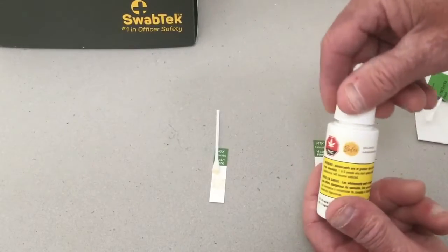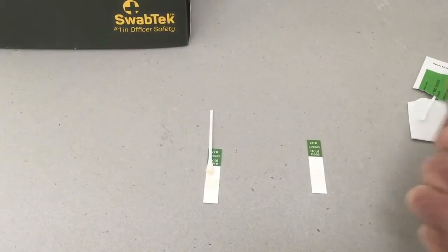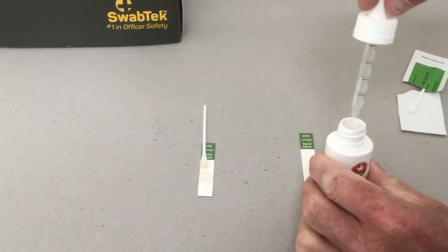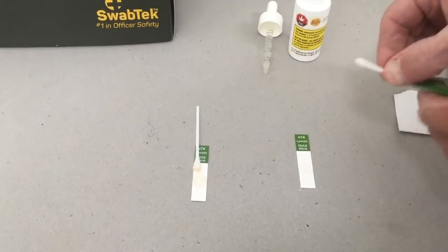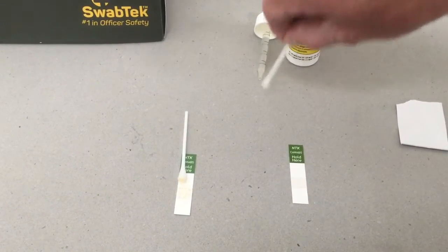Now we're going to actually look at some suspicious liquid. In this case, it does have cannabis product. And we open up the container. And let's just say, for example, there's a little bit of suspicious liquid there. We get another one of our swabs. This could be plant material.